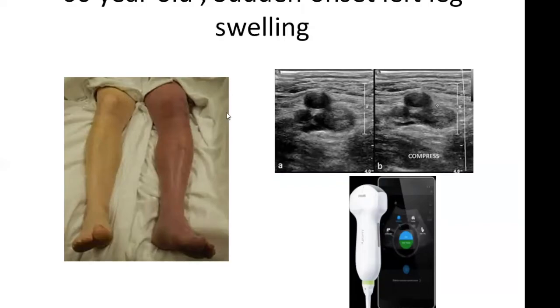Very easy to make the diagnosis, compared to the other side. So what you have here is outflow obstruction producing an ischemic limb. This is called phlegmasia cerulea dolens, and some patients do well by introducing a catheter using thrombolysis with an IVC filter to try and clear this, because they can have a poor prognosis with a post-phlebitic limb. So yes, this is what I saw last night with my iPhone ultrasound.